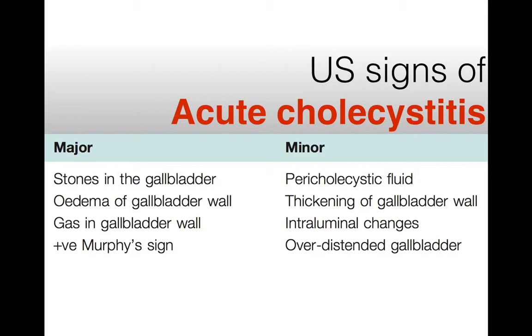But for pediatric patients, especially those with sepsis or operation or burn, or even premature, critically ill children, the cause of cholecystitis may not be the stone. Because of the critically ill condition, we call it acalculous cholecystitis. Despite this being the major sign, we will observe other specific findings like multiple layering of the gallbladder wall, gas in the wall, or even the echo-Murphy sign.